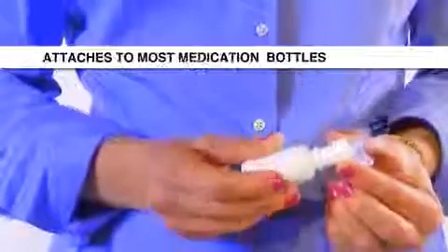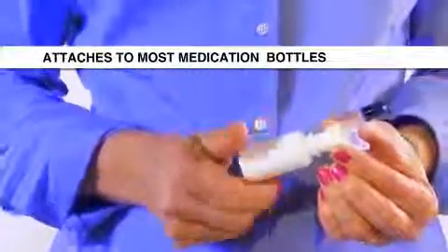Now let me show you how the Crest Dropper works. Before opening the package, be sure to wash your hands. First, secure the Crest Dropper to the top of your medication bottle.